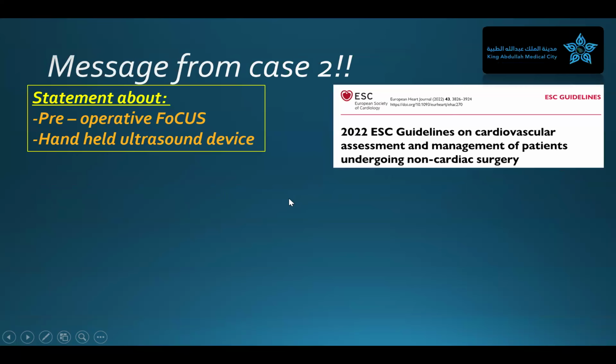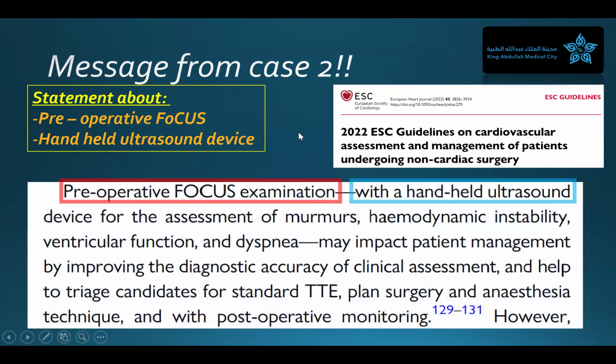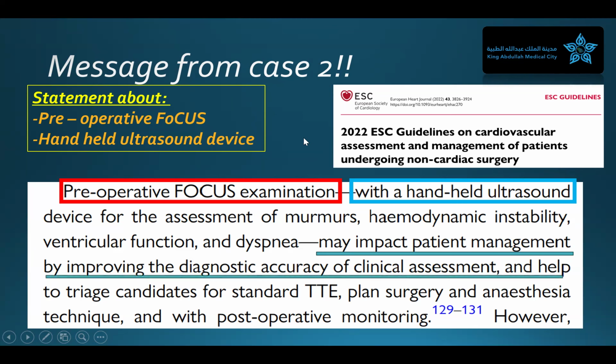Another statement in the same guidelines regarding pre-operative focused or handheld ultrasound is that it may impact patient management by improving diagnostic accuracy of clinical assessment and help to triage candidates for standard transthoracic echo.